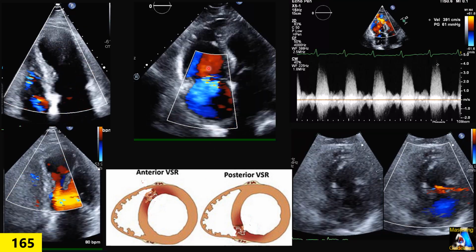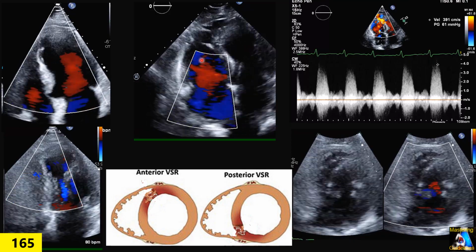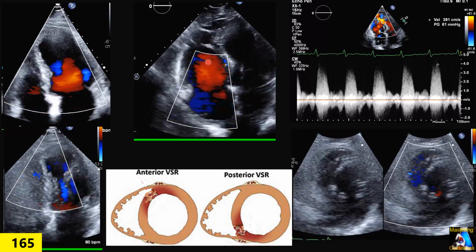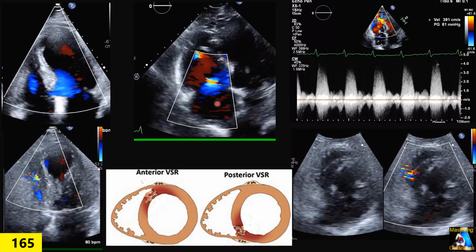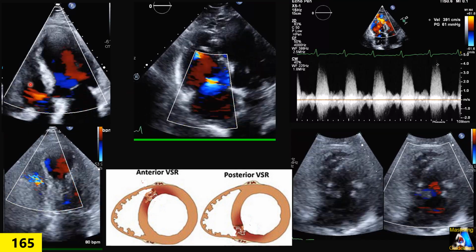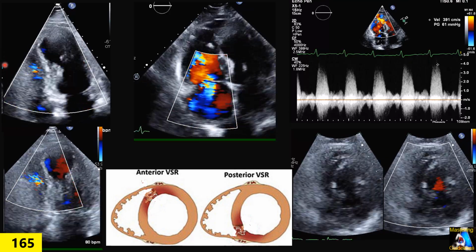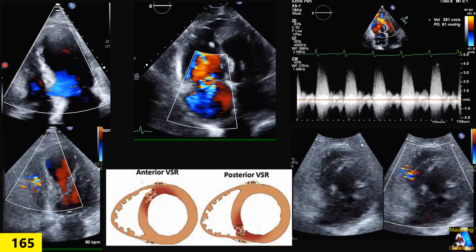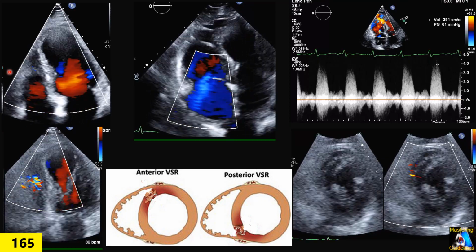If it's mirror image second, this turbulence is different from that. When you see any abnormal jet turbulence inside of the ventricle, left or right, it doesn't matter. Or here you can see an abnormal jet at the level of the mid right ventricle, here turbulence, watch there, below the moderator band at this level. There are two reasons for that.